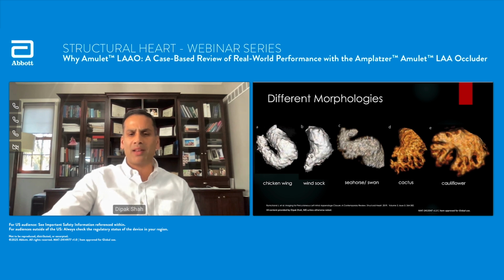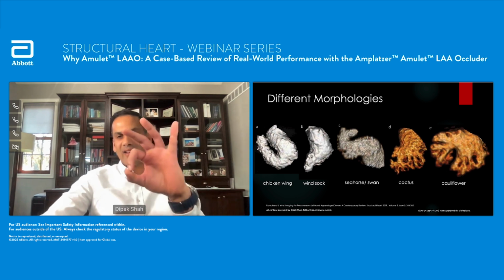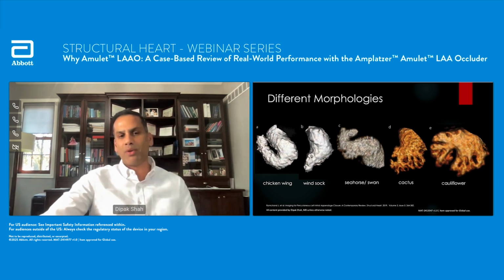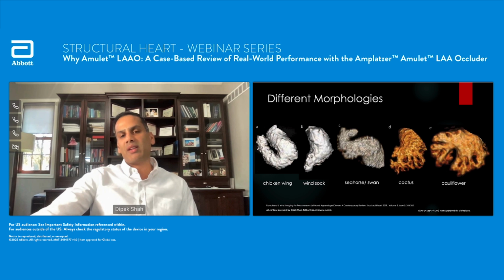Why I think the Amulet has such advantages over a single closure is that there are multiple reasons, but the more complex it is proximally, the more difficult it is for a single closure. Dr. Chris Ellis will tell you numerous times that if you look at the seahorse or swan configuration, and Dr. Dipak will probably get into this with specific examples, when it's angulated like this, you can put a lobe in or try to figure out how to do this with a single component. But if there's any tilting or rocking at 45 days or later on, there's going to be some sort of peri-device leak.